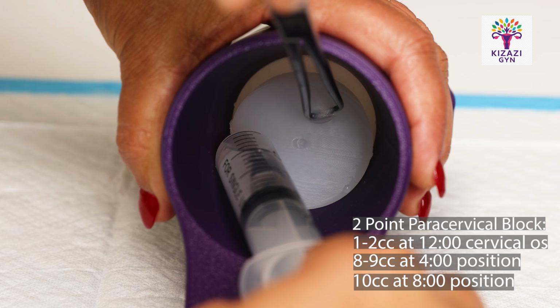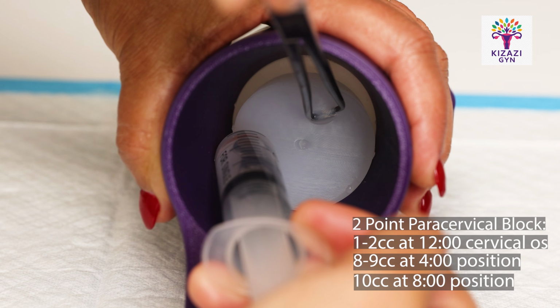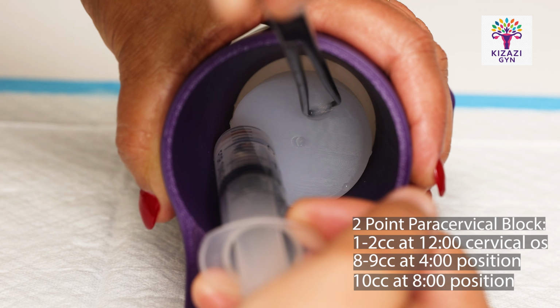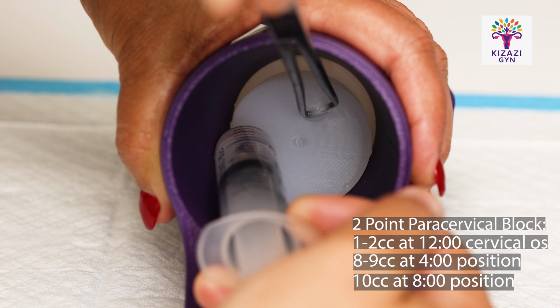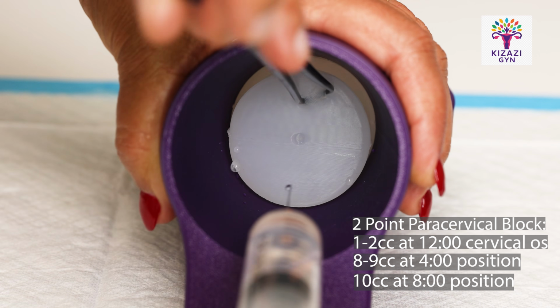You're going to retreat, aspirate, and then you're going to inject. If you feel resistance, you can either pull back or you can inject a little bit more. You can hear that it's going, and there will be a visual inspection too that you can do.